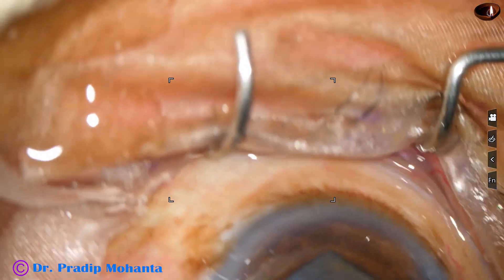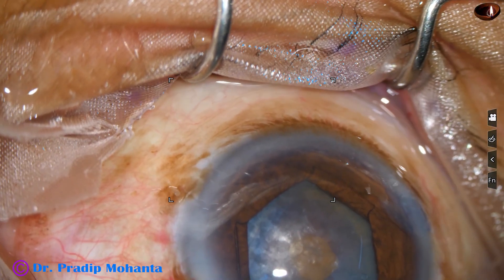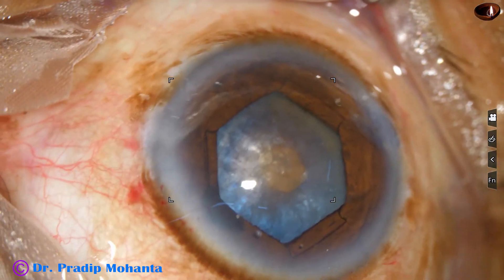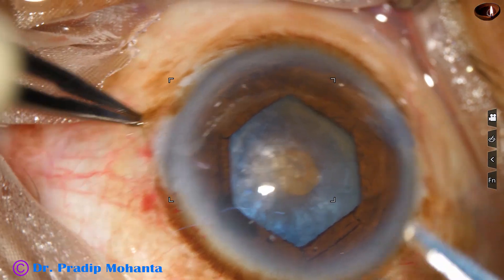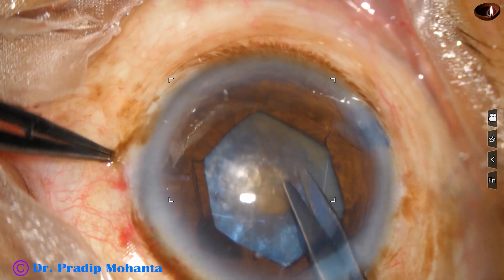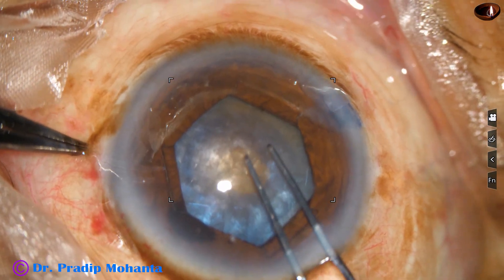It has no joints and is a very thin device. It can be used in a shallow anterior chamber. But in this case, to be on the safer side, I made the mini rhexis first, aspirated some cortex, injected visco, the chamber became deep, and then I administered this device. After aspirating some cortex and injecting visco, I am going to enlarge the mini rhexis now.